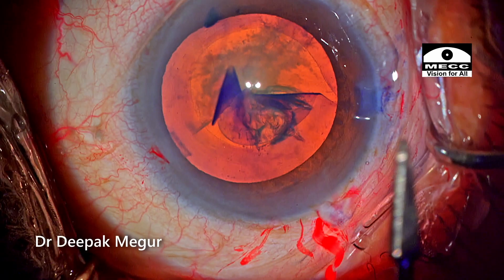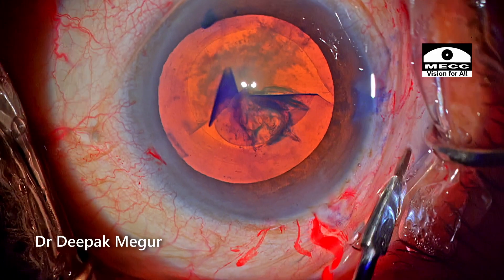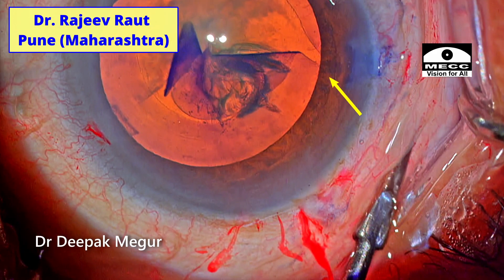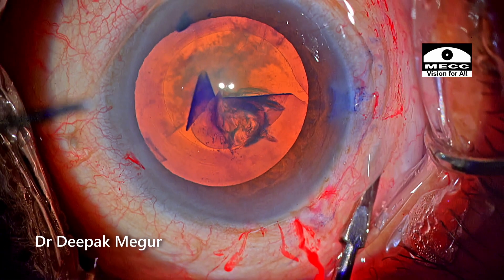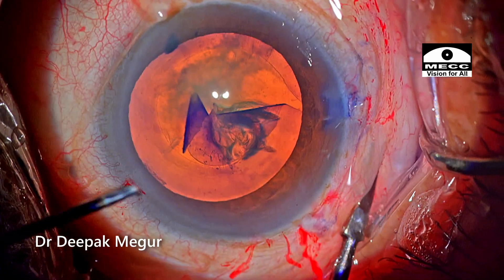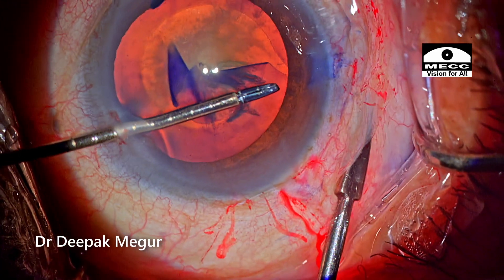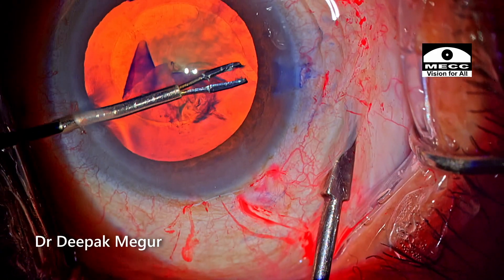I learned this technique through one of the social media discussions. Dr. Rajiv Raut from Pune had proposed this technique — that's what he uses. The idea is to depress the sclera so that the zonules are relaxed at that area, and the pulling in of the capsule can be done much more effortlessly.